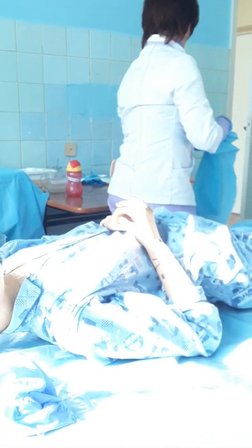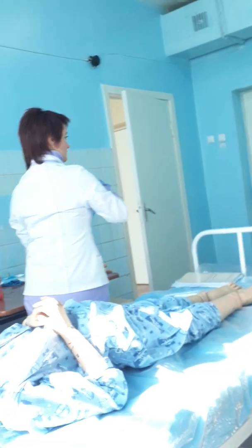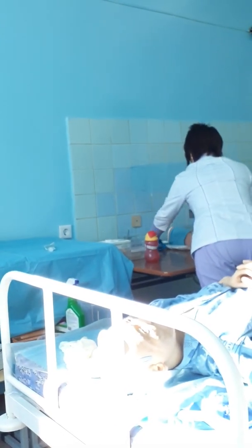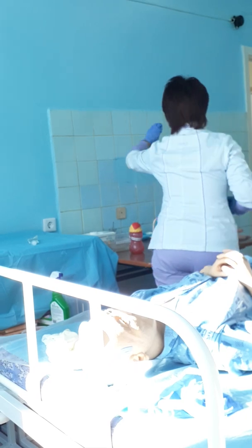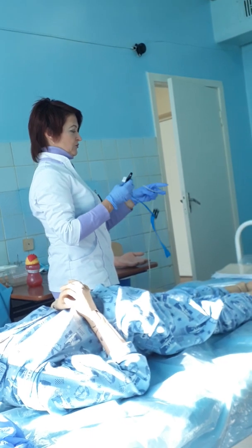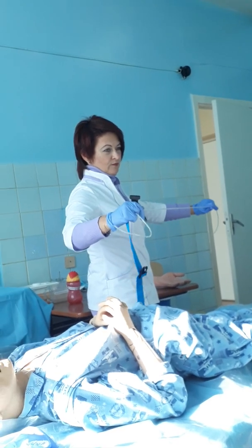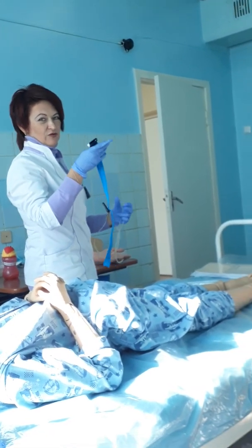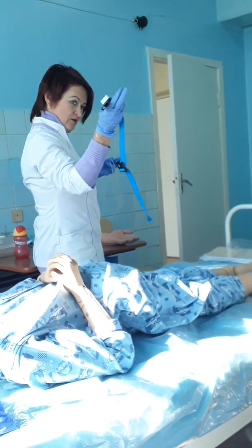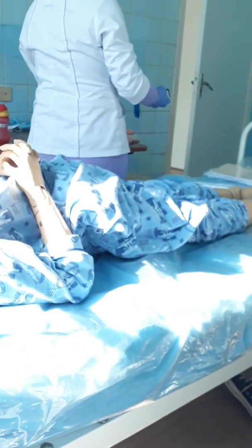After that, if your patient is without clothes, you need a special clean, not sterile, reusable napkin, and layer this napkin on the bare skin. Cover the skin, and only after that you prepare the tourniquet for venous. It may be a different type of tourniquet. It may be a special tourniquet for venous, or it may be a rubber tube, and you must try to do it using different devices. You can come to me and look at how I do it.